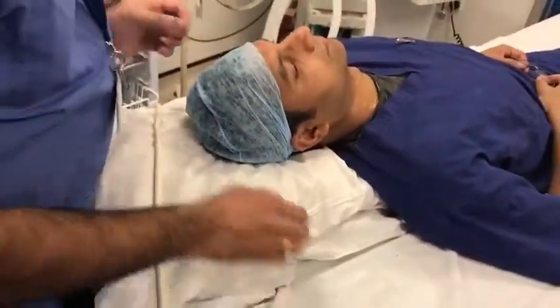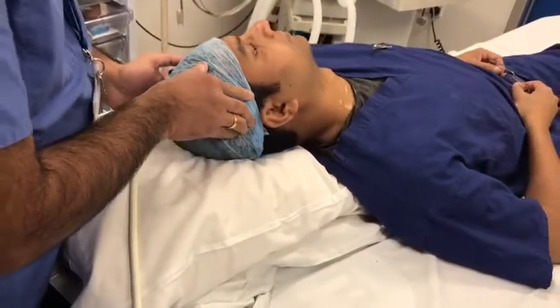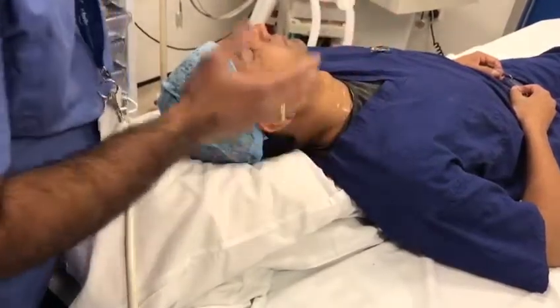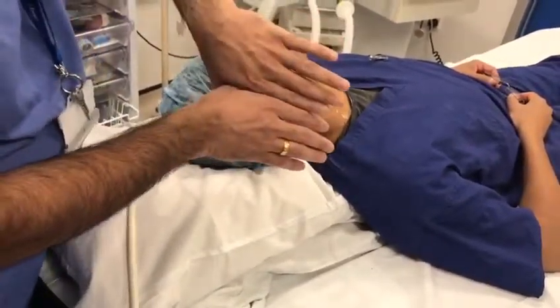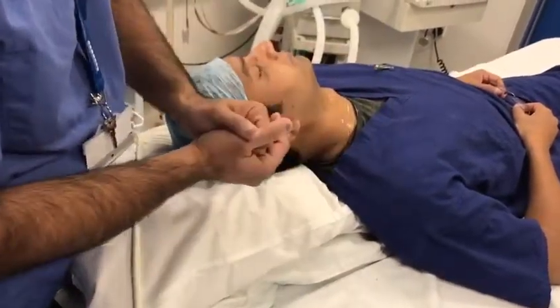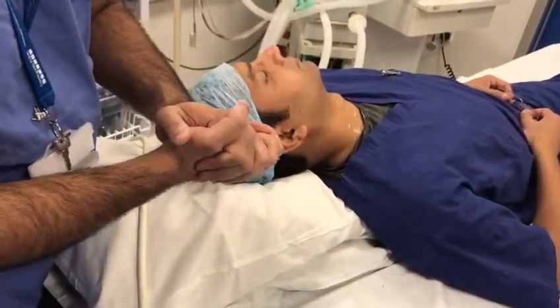Another important tip is to always ask the patient to move their neck to the opposite side, which gives you much more space to work. In this position, the majority of the vascular structures are pulled medially, which allows you to work in an area without major blood vessels in your needle path.